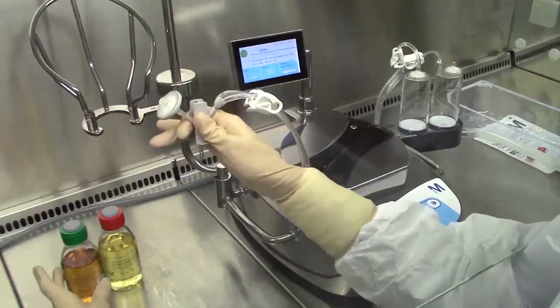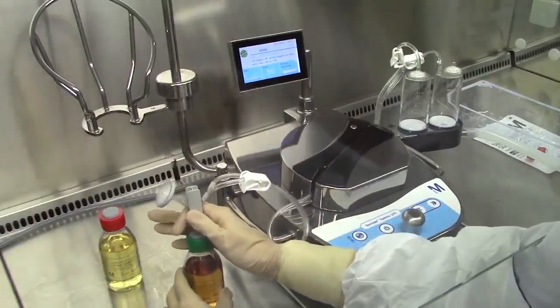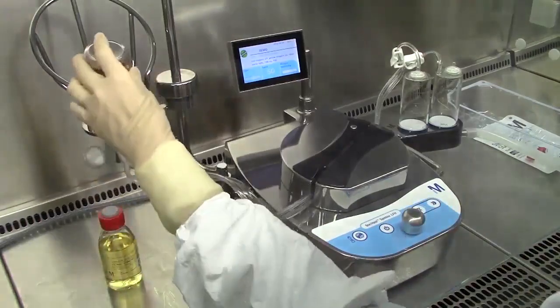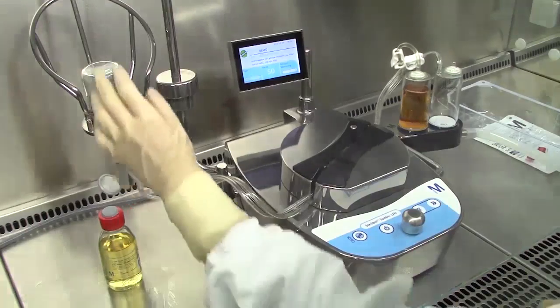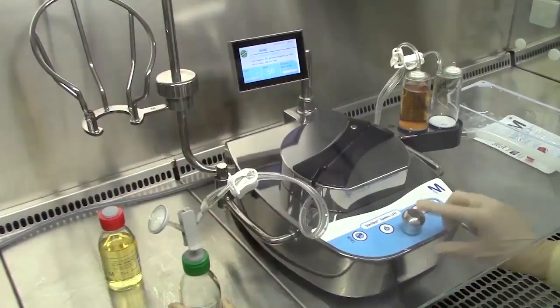Aseptically remove the tube set needle from the rinsing fluid bottle and insert it into the tryptic soy broth bottle septum. Start the pump. After a few seconds, invert the medium bottle and transfer the entire contents into the canister. Turn the bottle upright, wait for the tubing lines to clear, and stop the pump.